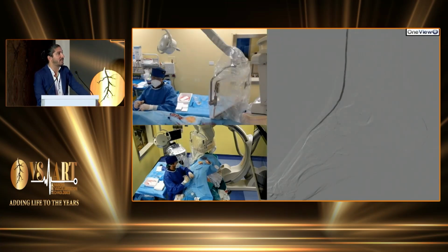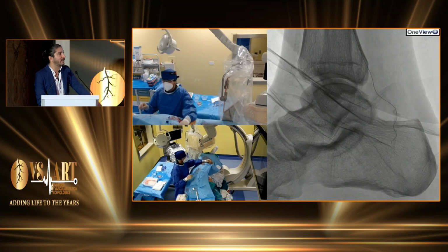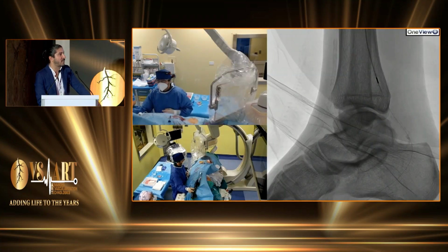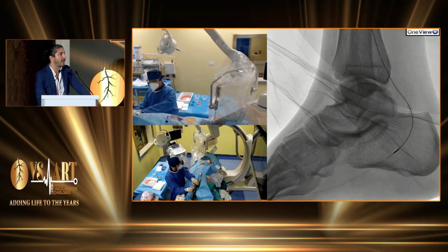Balloon angioplasty and DCB after OAS. This was a super selective check to check that there was no embolization. And another important situation with orbital atherectomy is that with one device we can treat more than one artery. In fact, I decided to engage the peroneal artery, the lateral plantar. As I described before, this anatomical variation was present, and using the same orbital atherectomy device, I did the peroneal and arrived till the lateral plantar without problems.